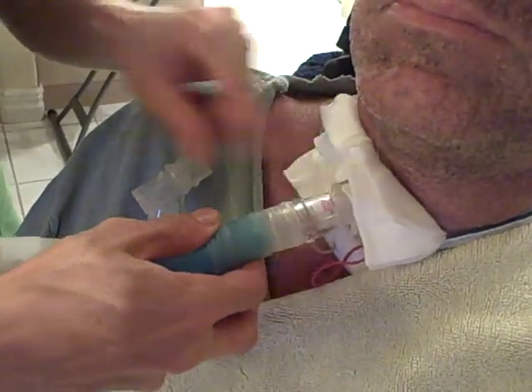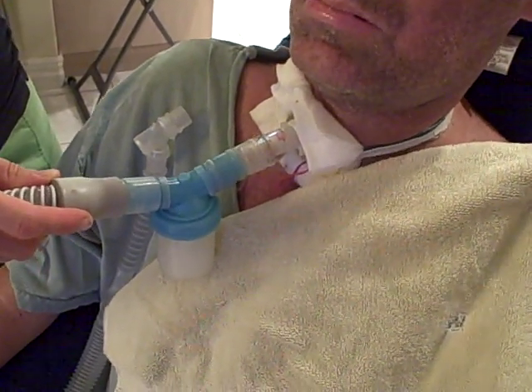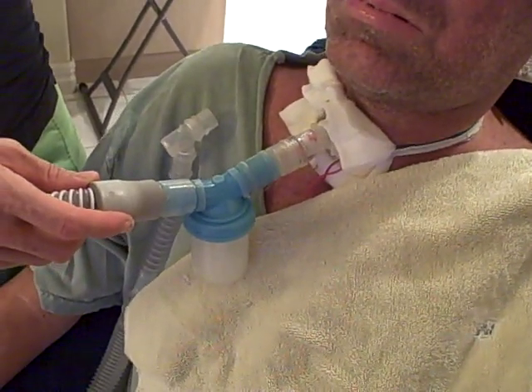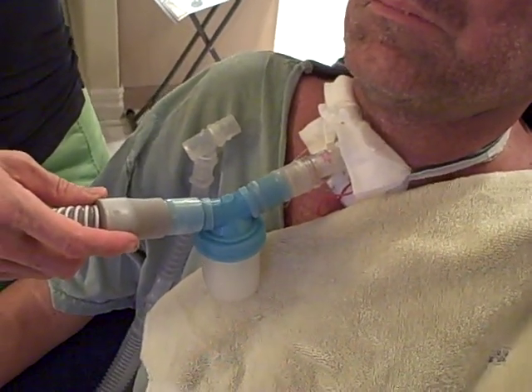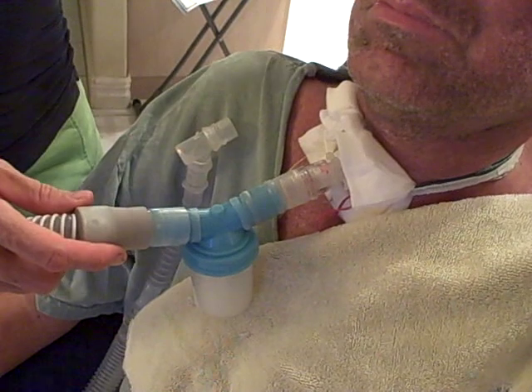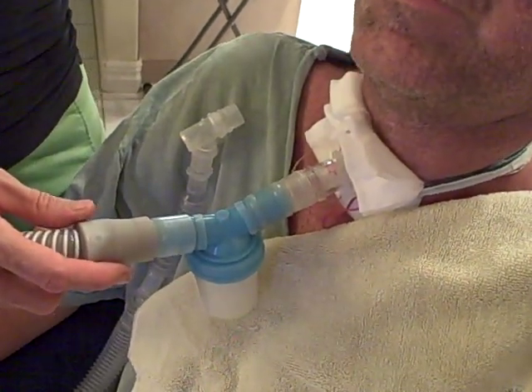Put this on and start it off — we go 12 to 15 breaths. Some days he has a lot that we get out, and other times not so much. We do this always twice a day, sometimes three to four times a day depending on if he needs it or feels like he needs to cough something up or out.